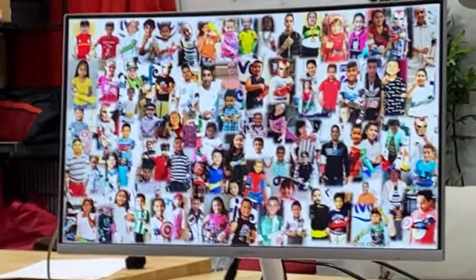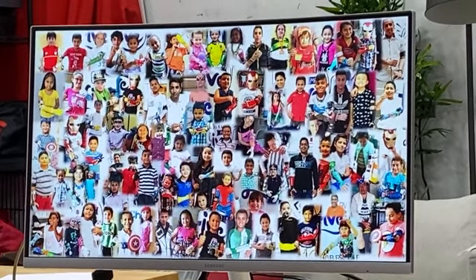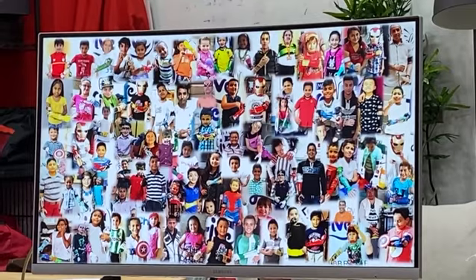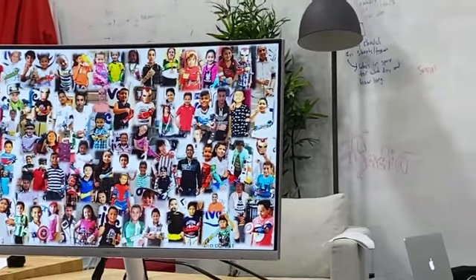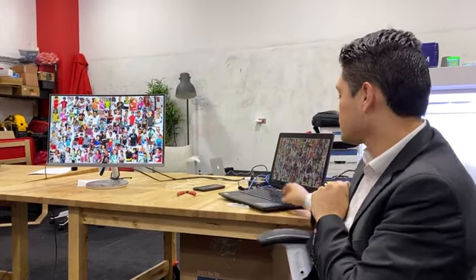So nowadays we have already fitted more than 260 3D printed prostheses to children, not only in Colombia, but all around Latin America. For example, last month I went to Mexico and I brought one 3D printed prosthesis to a child who received a 3D printed prosthesis 2 years ago. So we follow the process with them even if they are in another country, right?